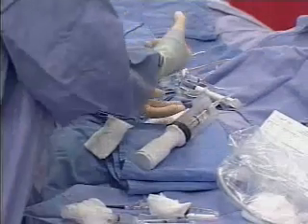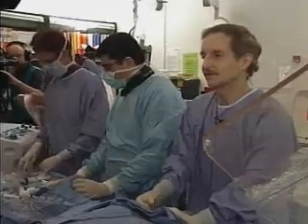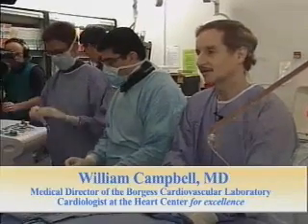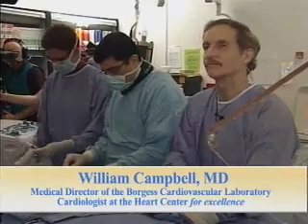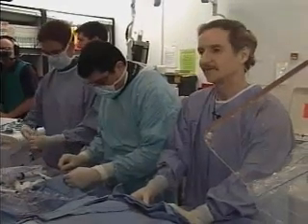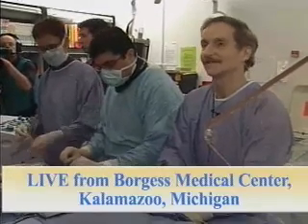Bill, do you agree with that? I agree. As opposed to previously with long stents, I believe it's 13% restenosis for every 10 millimeters of stent. And with the Cypher stent, the figures that I read were 1.6% for every 10 additional millimeters. So definitely the sirolimus is making a major difference.